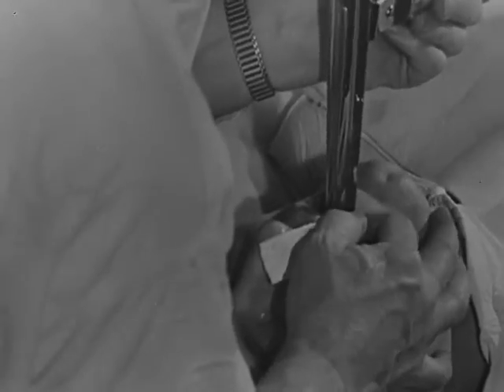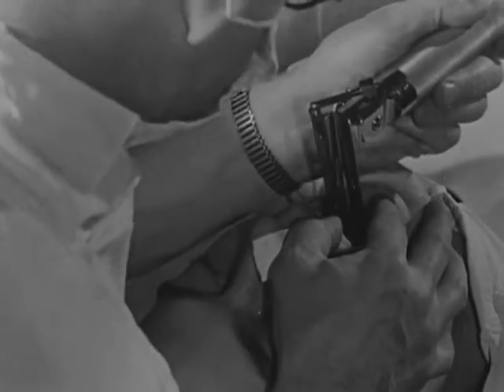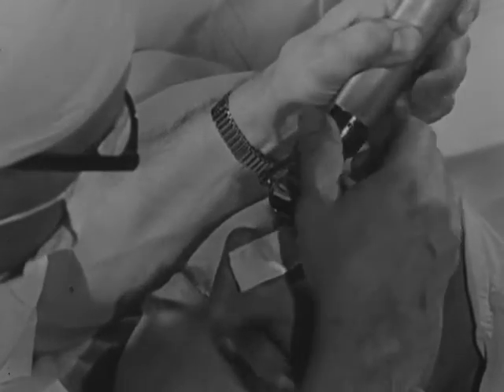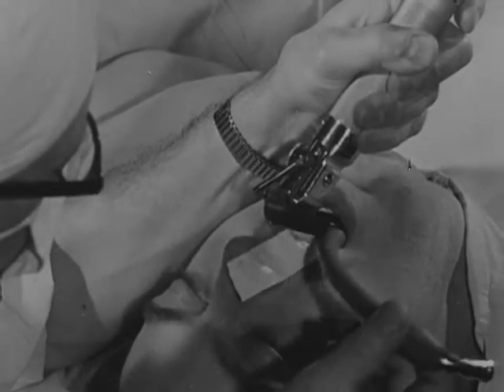When the glottis is open, the cords are abducted and the tracheal rings can be seen beyond. Once this view has been obtained, the tube can be slipped through the open glottis into the trachea. Watch for these landmarks closely as you insert the laryngoscope. Once the laryngoscope has been successfully guided into position, pass the tube down.